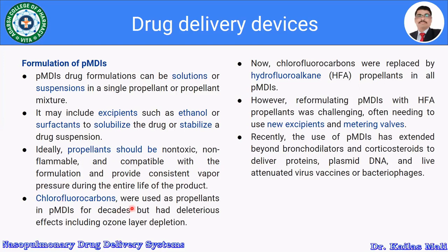Chlorofluorocarbons were used as propellants in pMDIs for decades, but had a deleterious effect on the environment, including ozone layer depletion. So nowadays, chlorofluorocarbons have been replaced by HFA, that is hydrofluoroalkane type propellant, in all pressurized metered dose inhalers.